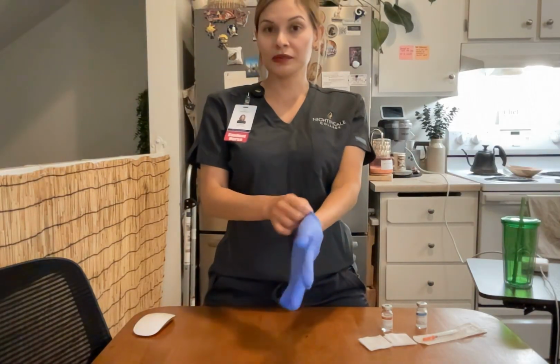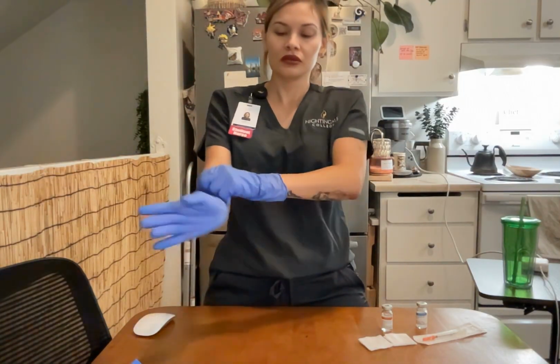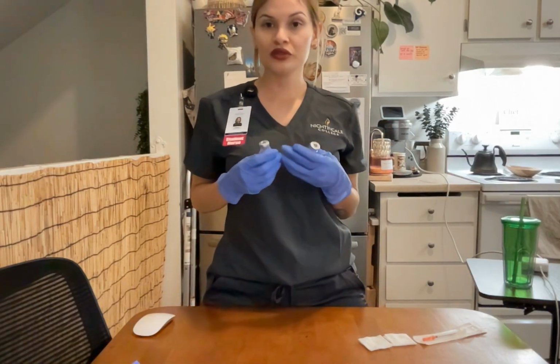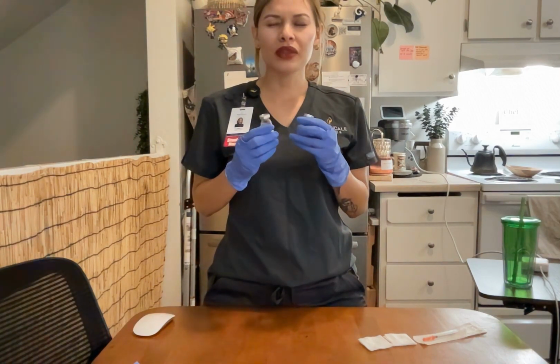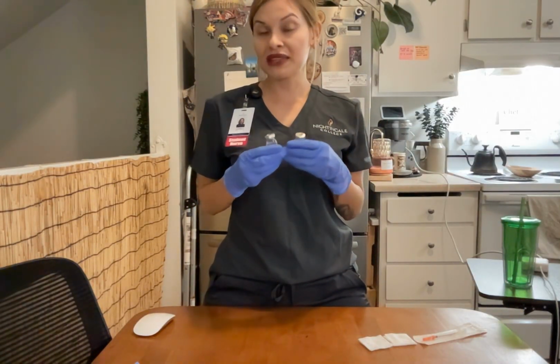Now I'm going to explain to the patient the purpose of my visit, maintaining eye contact with the patient. Okay, Mr. Lex, I am here because your doctor ordered insulin and it is going to be injected subcutaneous every morning before breakfast. So insulin is a hormone that lowers glucose in the blood to control blood sugar in patients with diabetes mellitus.